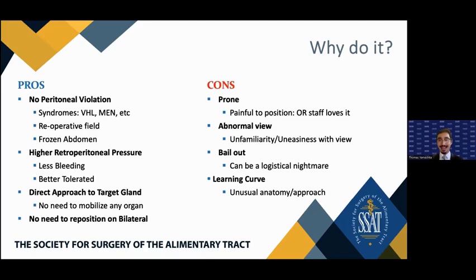So where the kidney is, where the IVC will be, where the liver is, where the peritoneum is, all of that is a somewhat unfamiliar and uneasy view, which kind of twists our head a little bit when we're doing the procedure. That's something to keep in mind. Because of that, and because of such a tight space, the bailout in case of an emergency is not as simple as just opening, right? If we're doing anything anteriorly, whichever approach you would like, we know that you can open and do a laparotomy. From the back, that's not the easiest thing to do. So the bailout can be a logistical nightmare.